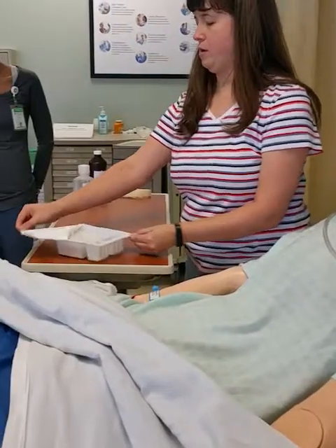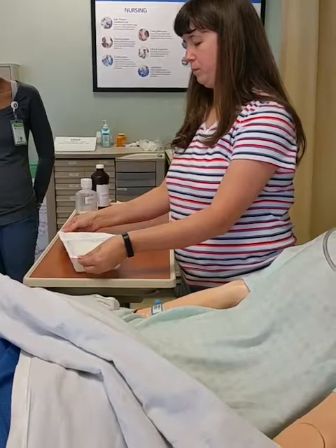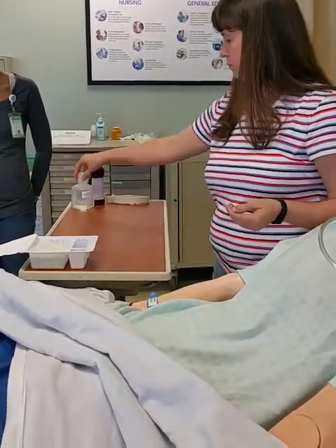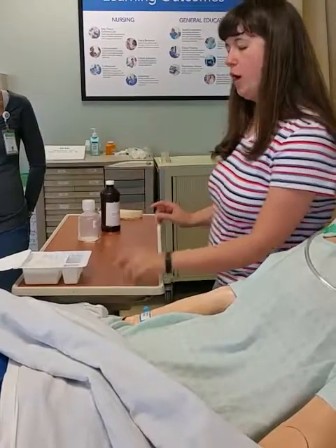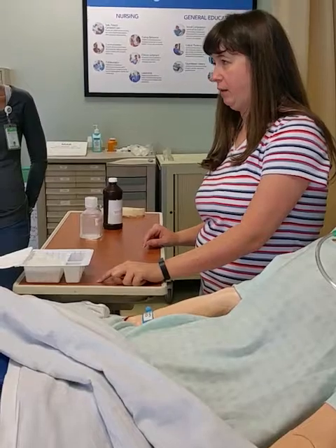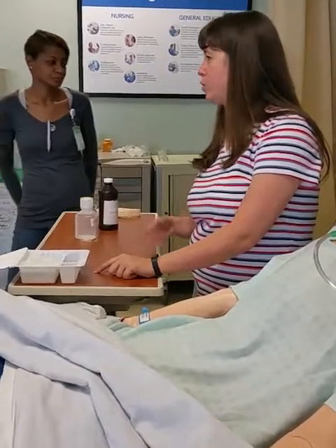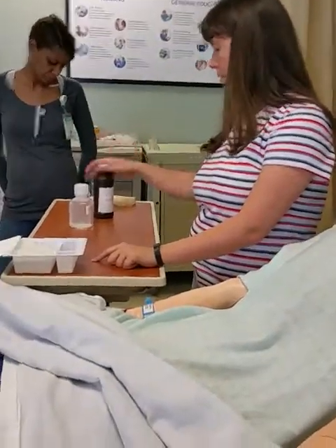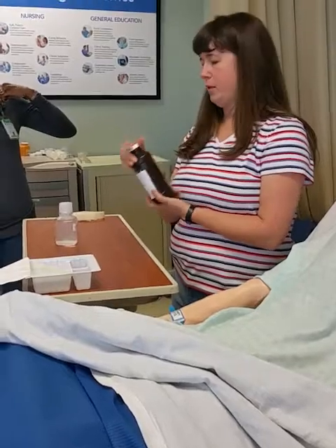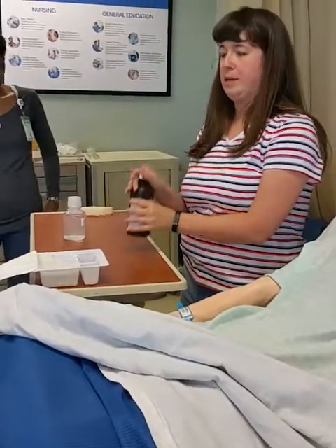Alright, so I'm gonna open my sterile kit. You're gonna do one container, half peroxide, half saline. The other container is going to be all saline. So you can decide which one you want to pour first. So I'm going to look at my hydrogen peroxide. New bottle, never been opened, not expired. Technically it's expired. Date, time, and initial.